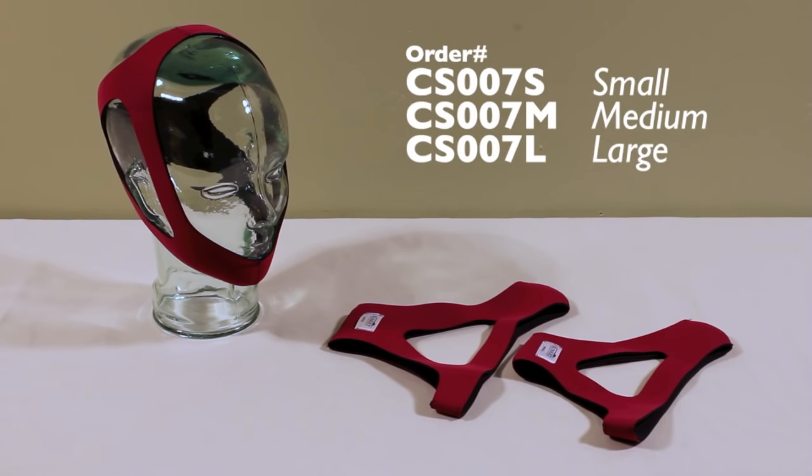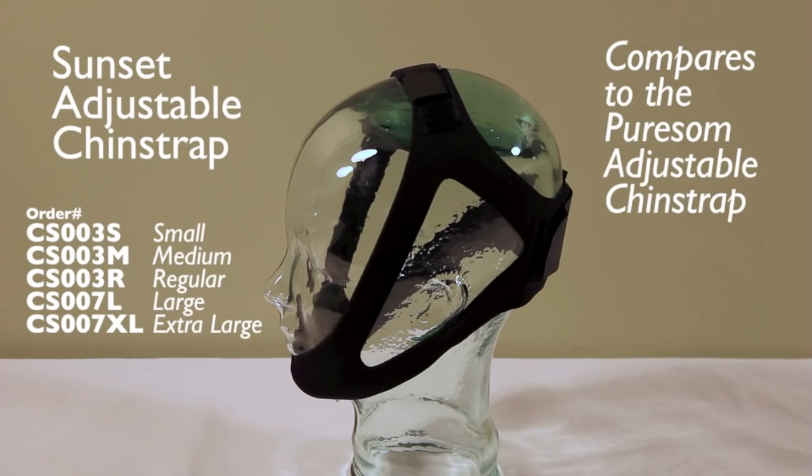These are fixed sizes as opposed to the Sunset adjustable chin strap order number CS003 which compares to the PureSOM ruby adjustable chin strap. It has 5 sizes and can be adjusted with velcro tabs across the top of the head and across the back of the head.